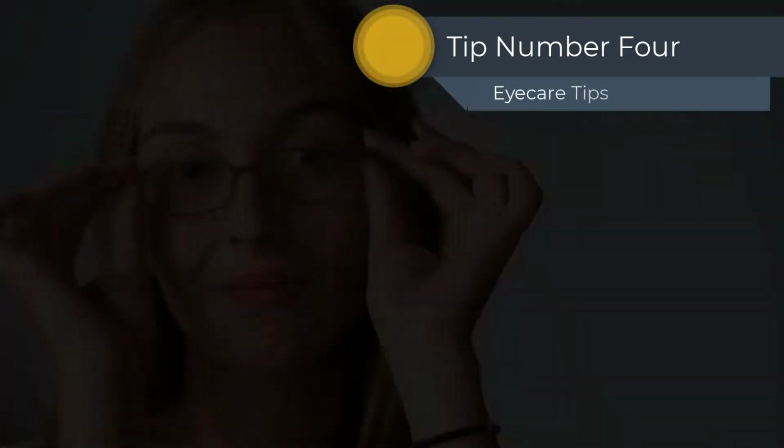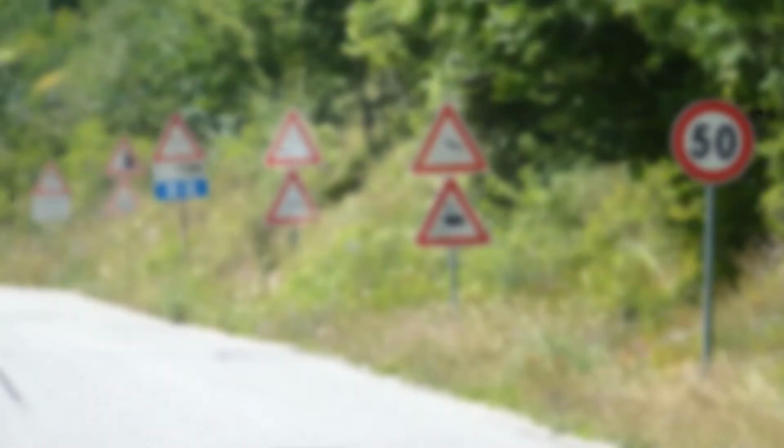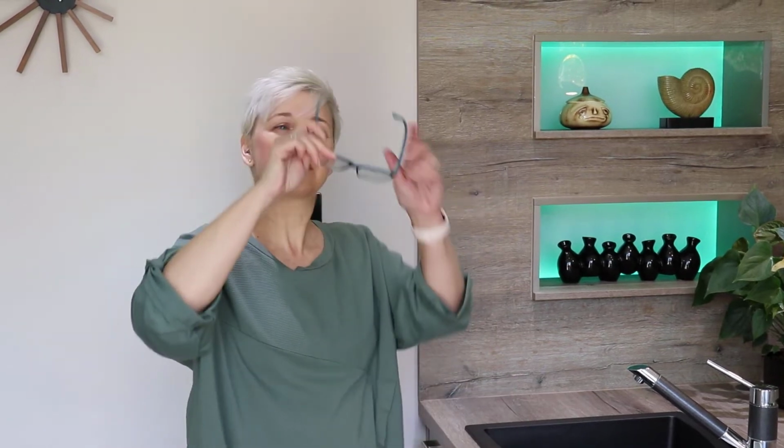Tip number 4 is the put on, take off procedure. Yes, there is a right way to put your spectacles on and take them off, and all it requires is for you to use both hands. Only using the one hand can cause your frame to bend out of shape, which could result in them feeling less comfortable to wear, perhaps even looking wonky, but most importantly of all, could dramatically reduce your viewing experience. Also, don't place and rest your spectacles on the top of your head, as this can also stretch your frames.